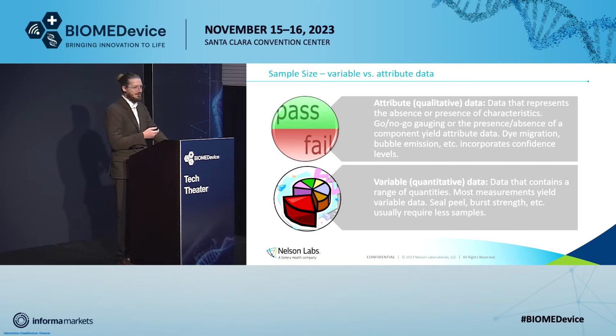Some tests that we perform are either qualitative or quantitative. Data that's qualitative will usually necessitate higher sample sizes. If it's dependent on an operator to judge with their eyeball and say, yeah, this passed or this failed, that's not as reliable as data that will give you a nice hard, fast number. So that can also play into your decision of, for this test, I might have this as my sample size. For this other test over here, it will be higher or lower depending on the qualitative or quantitative method.